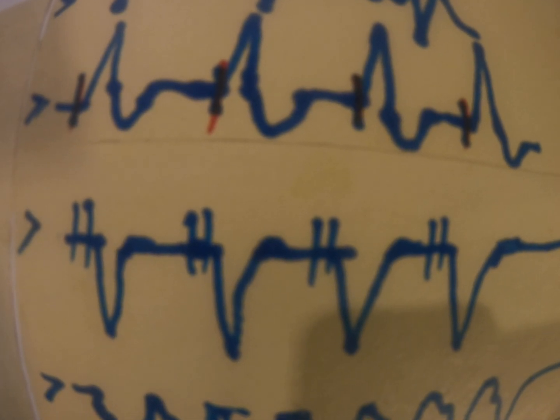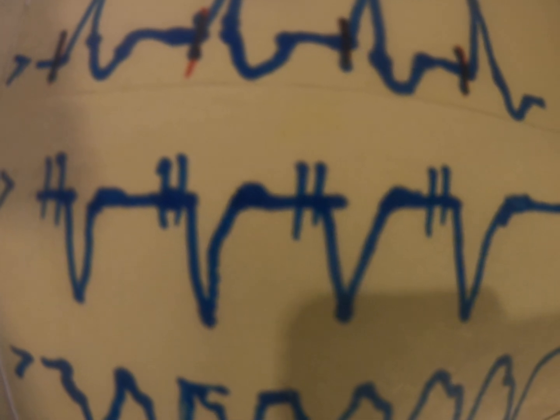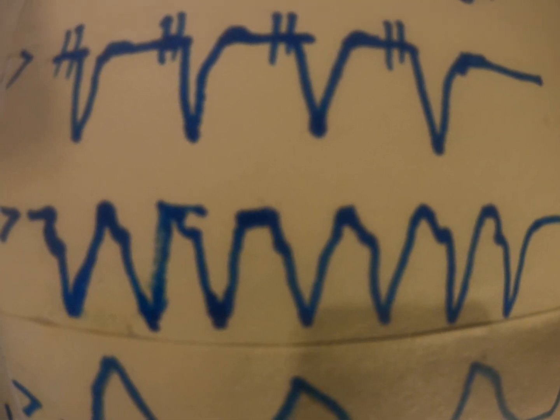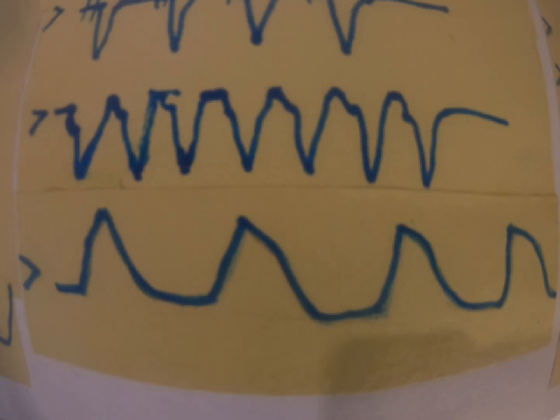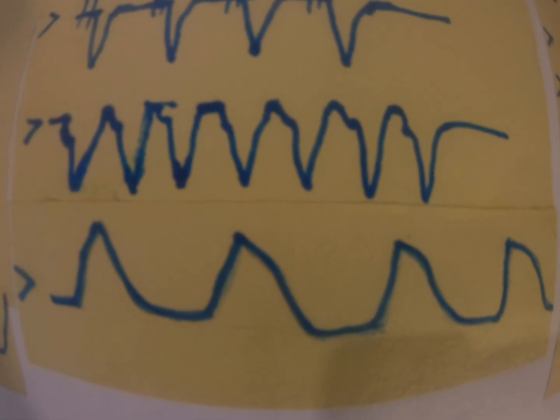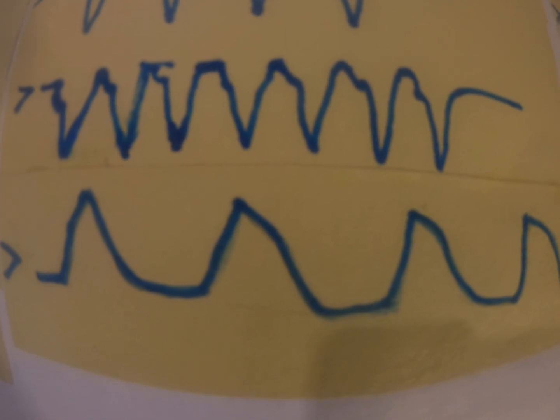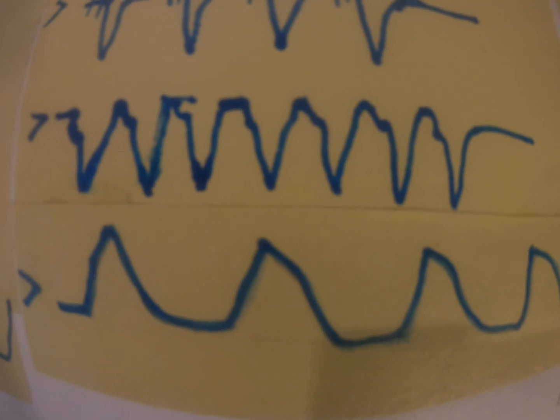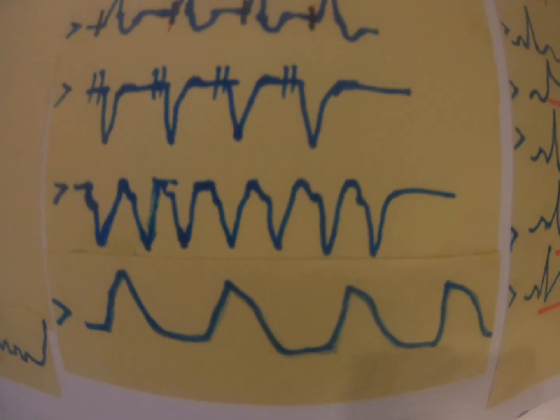Right ventricle, left ventricle, each one has its own pacemaker. Next is the monomorphic VTAC, which is wide. Okay, the last one is an agonal rhythm. Either it is a too late resuscitation, the patient is dying with this kind of rhythm, or if they make it, cooling protocol and so forth will be in ICU.